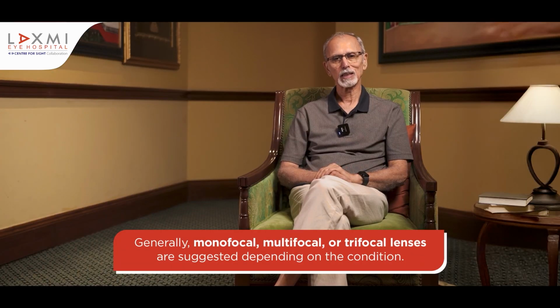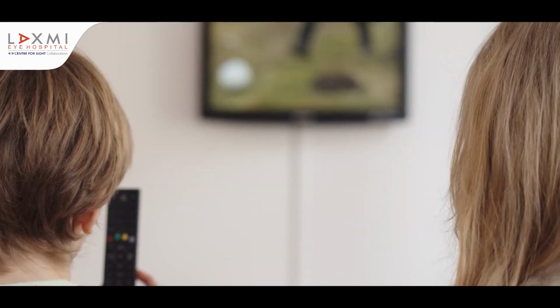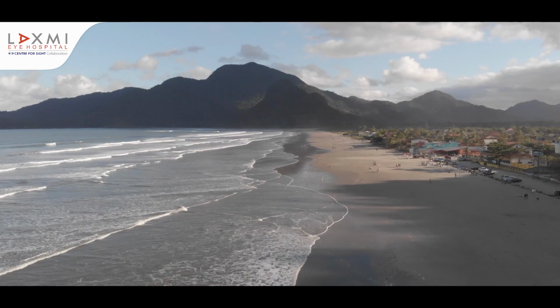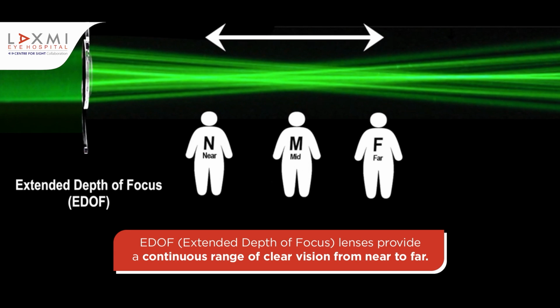we have trifocal lenses. When we say trifocal lens, that means that lens is able to focus at near, at an intermediate distance, and at infinity. And now a newer category of lens has come, which is called an EDOF lens, or an extended depth of focus lens. That means that lens gives you a focus at an intermediate distance, or at infinity, or from intermediate till infinity.